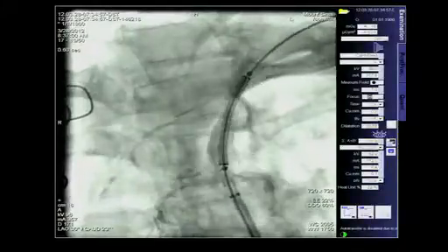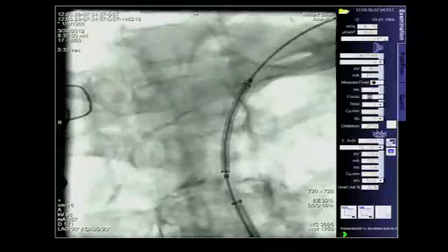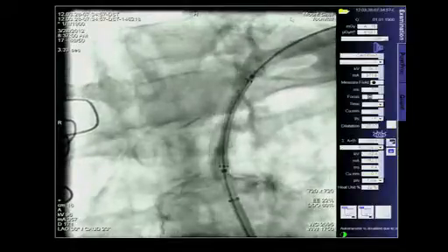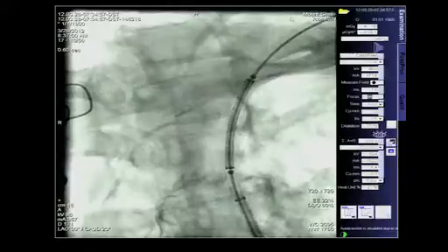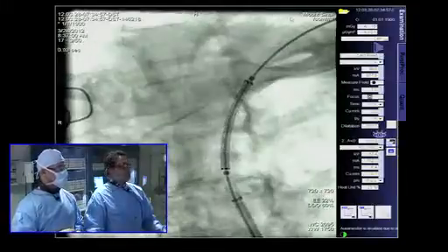So I'm actually going to stent it in this view if it's okay with Dr. Wiley. I agree. I think it's excellent because you kind of see both, and you're not really trying to cover the ostium here. Although people could argue there's a little bit of a minor stenosis, and I think we're going to get a lot of comments on that. To me, you could go with a 7 and nail both. And I'm going to discuss that with Dr. Wiley, whether we need to upgrade this, or I think you're okay with leaving it. No, I think we're okay here.